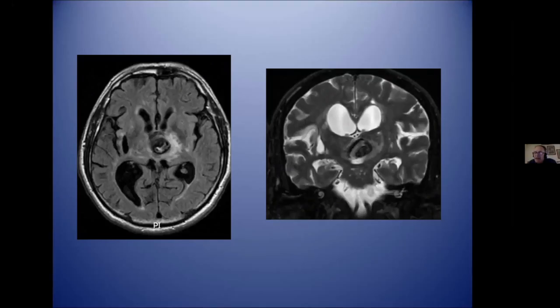It's an open cell. I prefer not to use the flow diverter stent in the basilar territory or in arteriosclerotic aneurysms, because the radial force is not stiff, and with the flow, the stent grows and elongates more.